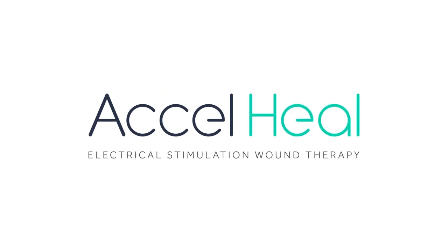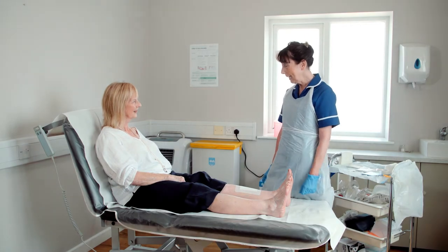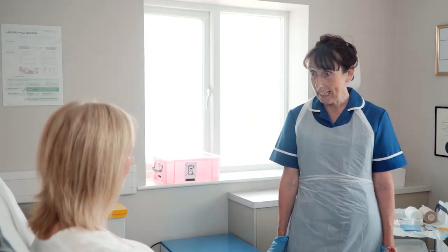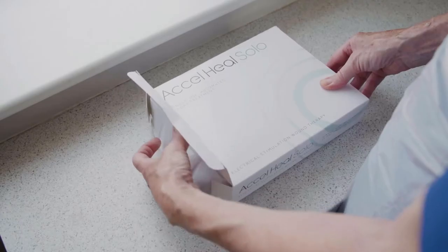This instructional film is intended to demonstrate the application of Axel Heal Solo alongside compression wraps. Our process starts once the primary dressing has been applied to the wound.